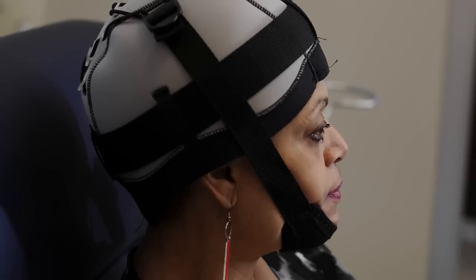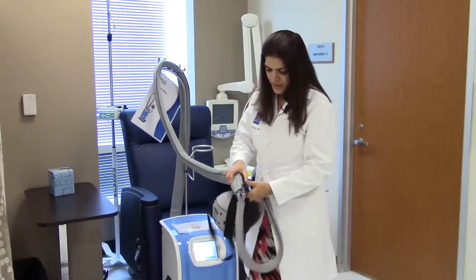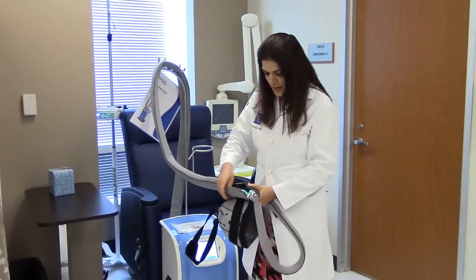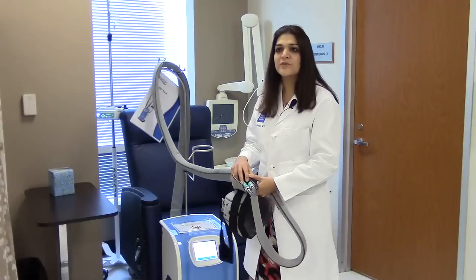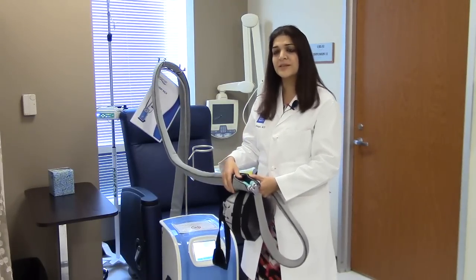The device is worn for 30 minutes before chemotherapy, during chemotherapy, and for 90 minutes after. You can actually detach right here from the machine and be detached for 10 minutes, so that patients can use the restroom or move to a different place in the clinic.